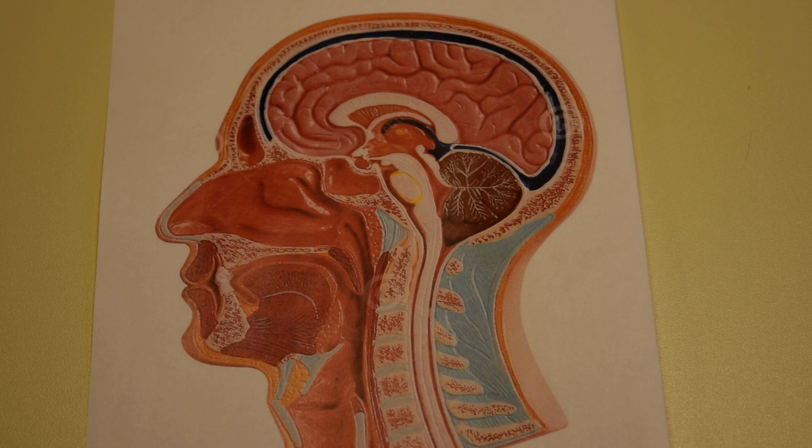I caution people to at least check in with the physician regarding this, as xylocaine should be prescribed, but it will alleviate some of the difficulty that you're running into with your patient. So I strongly recommend obtaining that piece if you think of it, and it may be helpful for everybody involved.